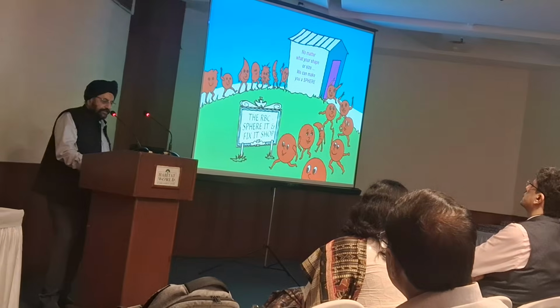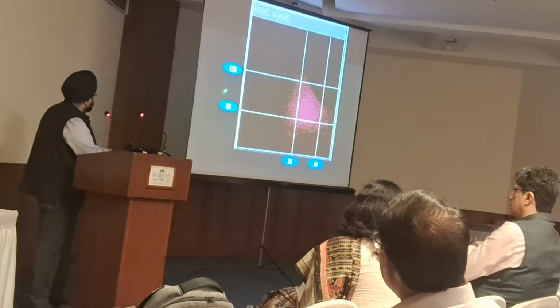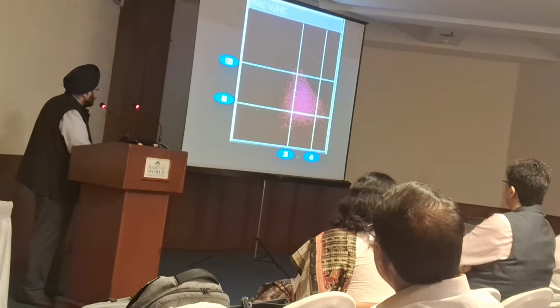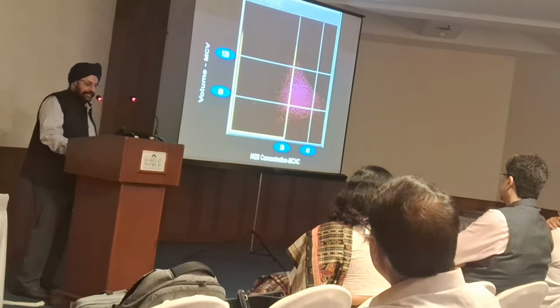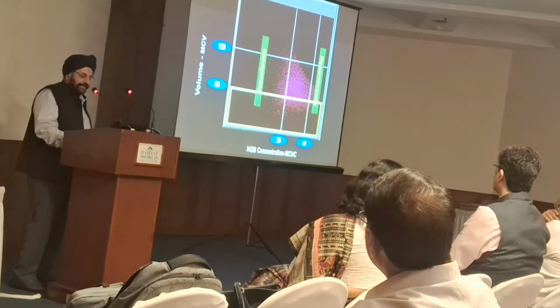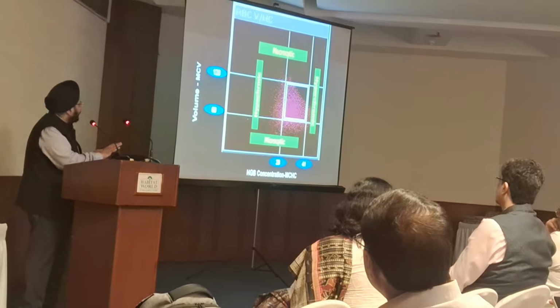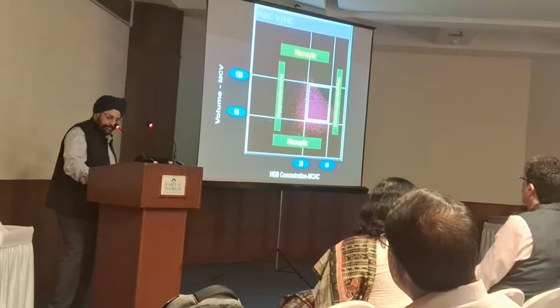So we first spherize all the RBCs, and then this is the scatter plot. On the y-axis is the MCV with two determinants at 60 and 120, and on the x-axis is the MCHC with two determinants at 28 and 41. It is obvious. This left area here is the area of hypochromia, this is hyperchromia, this is microcytosis, this is macrocytosis, and this middle square here is the area of the normocytic normochromic. Even without looking at any of the indices, just this scatter plot is going to give it away in most cases.